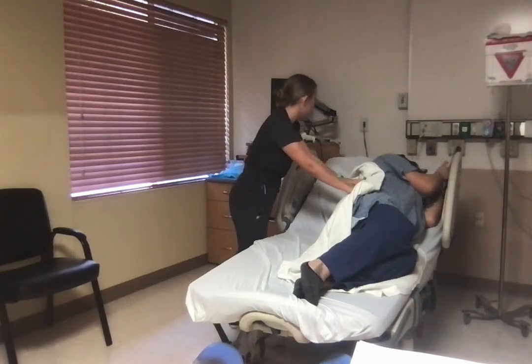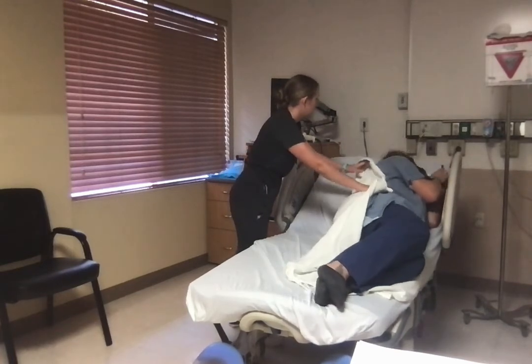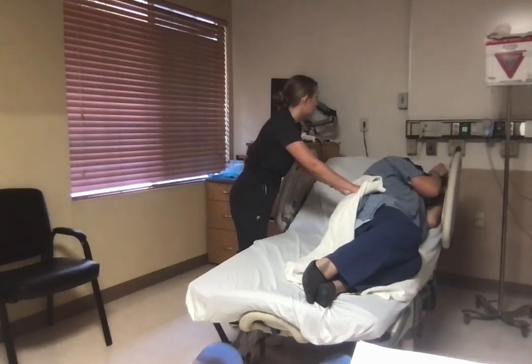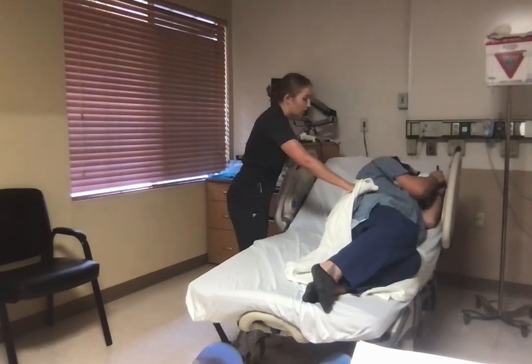Okay, how do you feel in this position? I feel okay. Is my baby okay? Baby's heart rate is actually going back up right now, so this position looks like it is helping. So I'm going to go ahead and leave you here for about 15 minutes, and I'll be back in 15 minutes, okay? Okay. Do you need anything before I leave you? No. Okay.